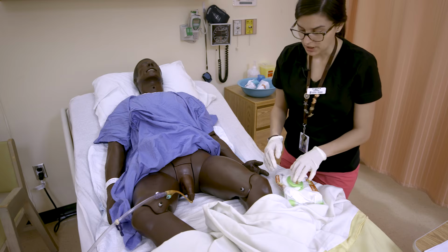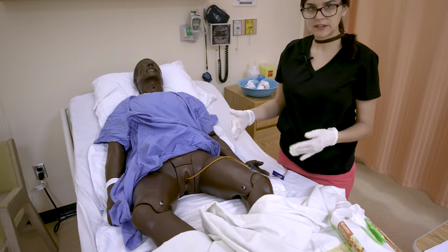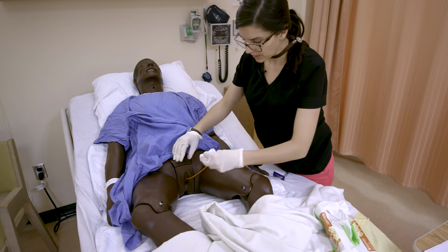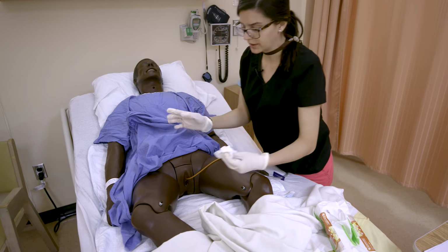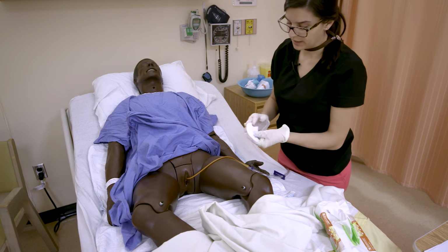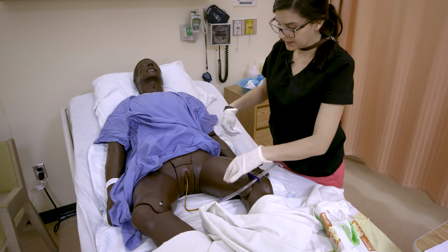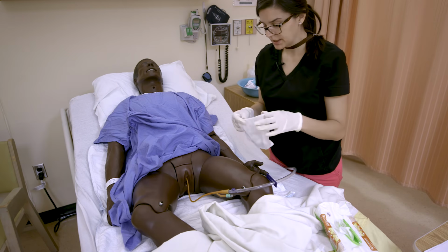So we'll just show, for example, with a female now. So for a female, similar principles again to peri-care, but we just want to be mindful of that catheter that's there. So we're going to start here at the outer labia and go down, and you're always going in the direction of top to bottom, so towards the anus. And if there is a clean portion of the cloth that you can use, you're going to do the same on the other side and go down towards the anus. And you may need a new cloth or wipe at that point.